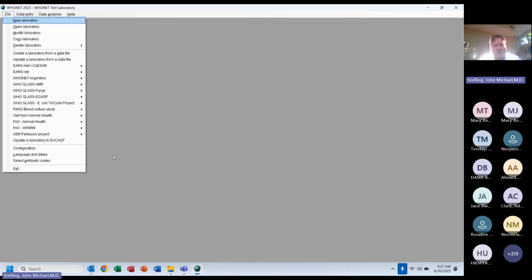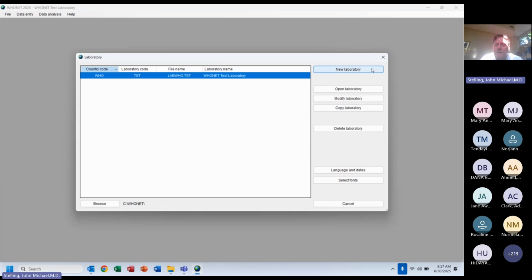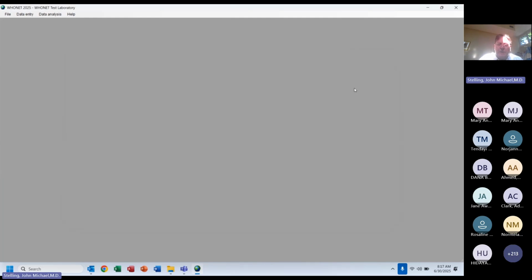And then the next time, when I open, it's not going to ask again. It just asks that one time if I say yes, or if I say no. And if I say ask me in a month, it'll just ask you next month. And that gives you more time to learn about it. Okay, good. So I am now in WHONET.